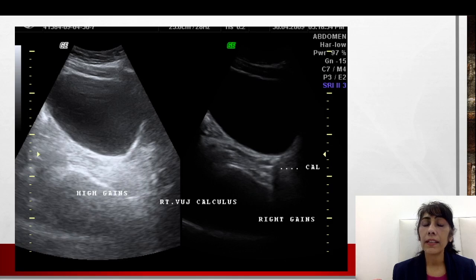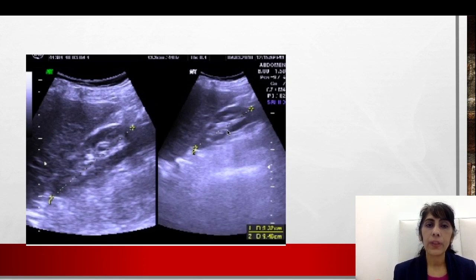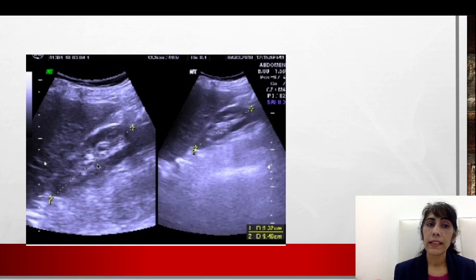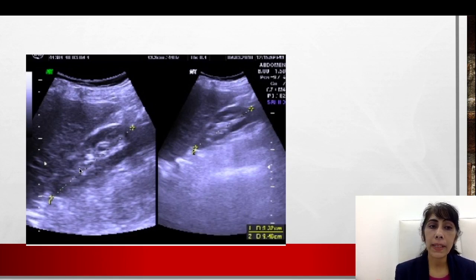This was a pelviureteric junction calculus that could have been missed if the gain setting had not been done properly. Basic concepts are very important and you should learn in a proper manner. Let me give you another example — I want to study the kidney. Here are two images of the kidney. Which would you prefer? Obviously the one with better depth is a better picture. Something looks suspicious in one that we are not seeing in the other — we might miss a diagnosis simply because we did not keep the depth proper.